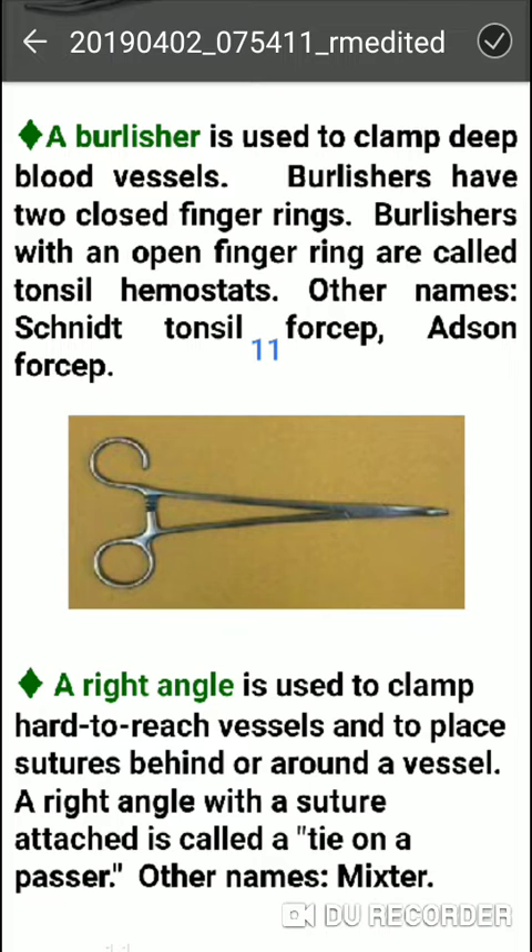Next is the Right Angle hemostat. It is used to clamp hard-to-reach vessels. It is also used to place sutures behind and around vessels. When a right angle instrument is used to pass sutures around vessels, it is called a tie-on-a-passer. Another name is Mixter.